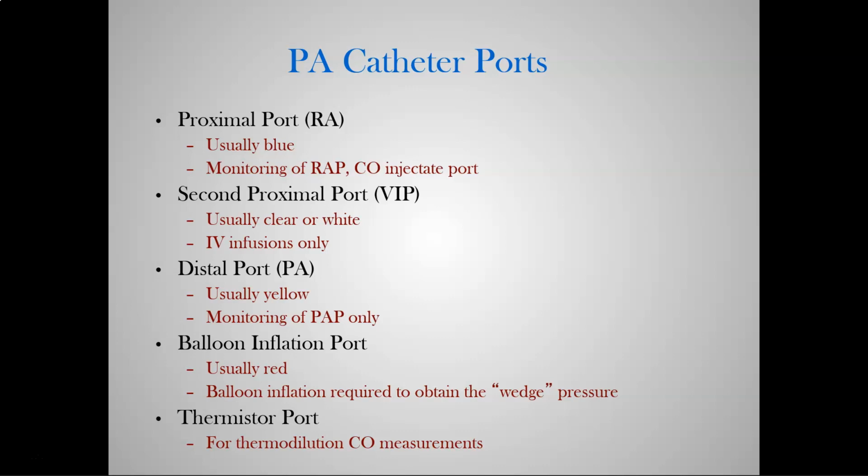Not only does it block off flow, but it actually stops platelets, can form clots, and the blood just sits there static. We don't want that. When I say inflate, this balloon is inflated for a matter of seconds. You don't just leave this balloon and, okay, take a 15-minute read, your patient will be dead in 15 minutes. There is no 15. This is a matter of seconds. Okay, we get our reading and immediately deflate. It's very simple.